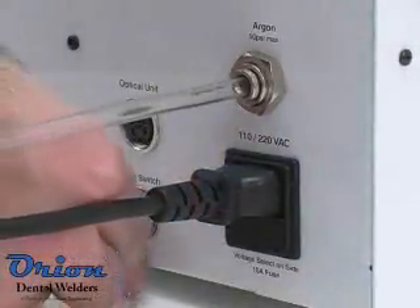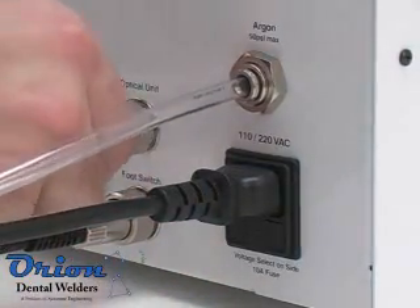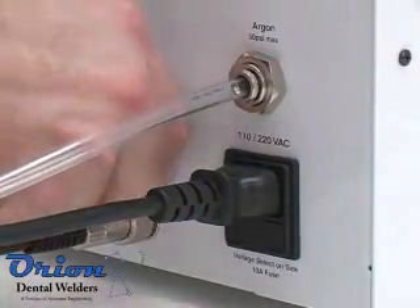It is critical that the Orion microscope be plugged into the optical unit port on the back of the Orion welder in order for the shutter to function.